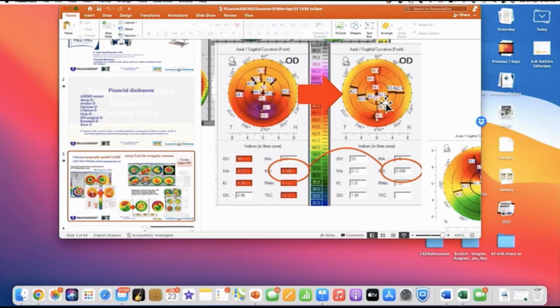That's an excellent question. Only God knows. Because the question translates, and it's a very good question, when is this cornea stable? We have a presentation in this meeting looking at the epithelial remodeling after the combined procedures. And usually, in my experience, these eyes stabilize refractively by month 3 to 6. But we've also published 10-year data showing that there's a slight tendency towards the cornea flattening. And in 2% of the cases, the cornea flattens a lot.